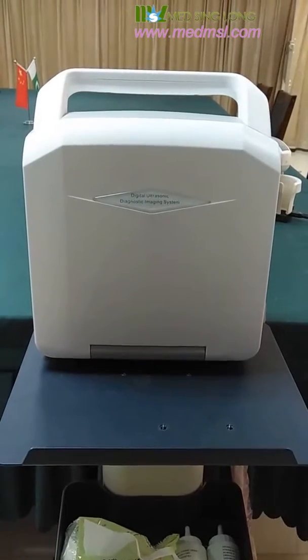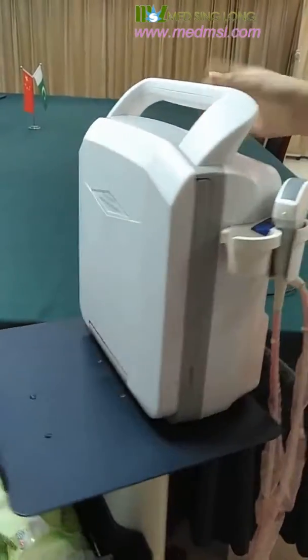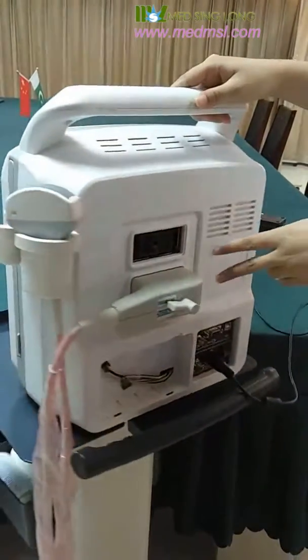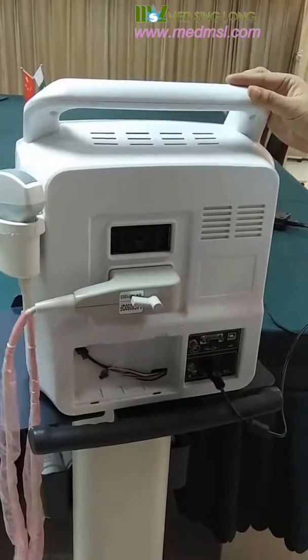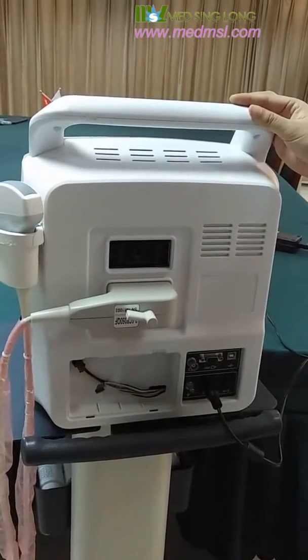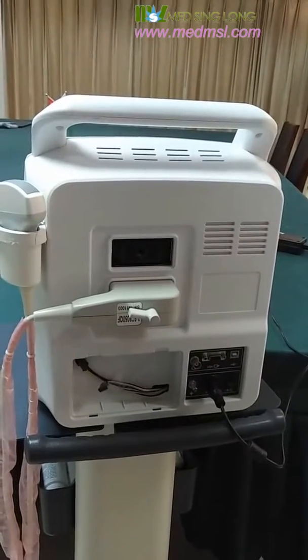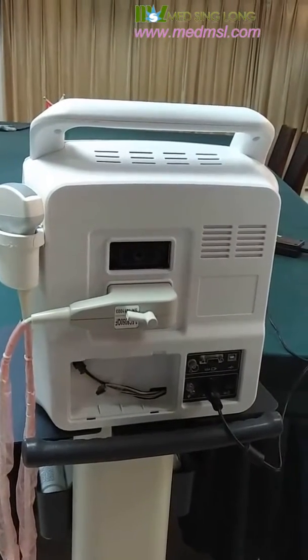It has a fashionable appearance with two hooks here and two probe holes here. You can choose different probes according to your requirements, such as a convex probe, linear probe, transvaginal probe, and micro-convex probe.